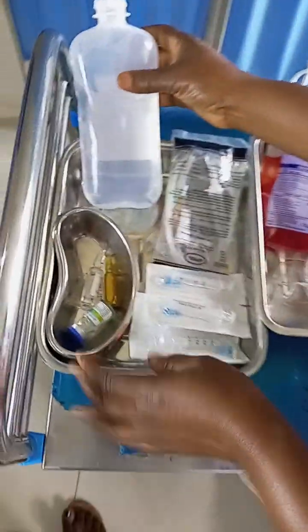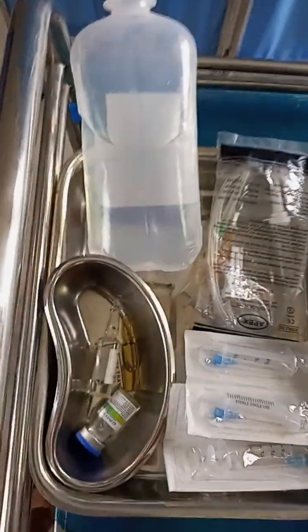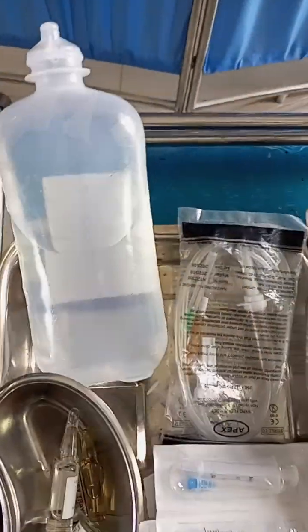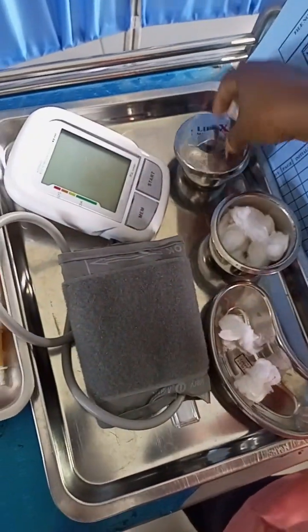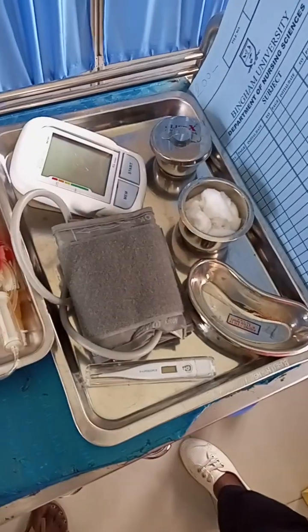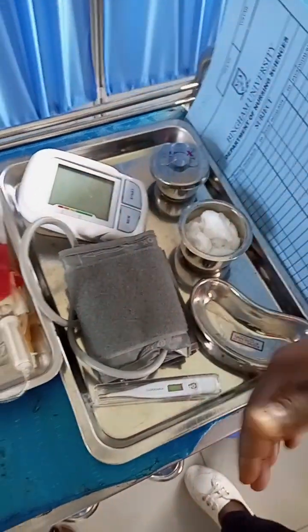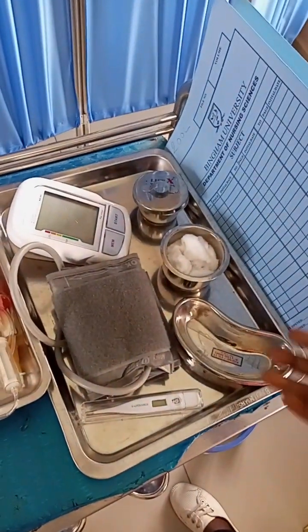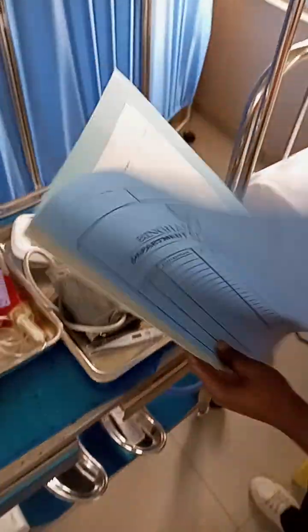My emergency tray containing furosemide, hydrocortisone, promethazine, normal saline. And this is the blood that I've collected from the blood bank, of course. This is my tray for vital signs. Remember, when you are transfusing blood, monitoring the patient's vital signs is very, very important. So my requirements are set, and of course I have my patient's file, which I will cross-check.